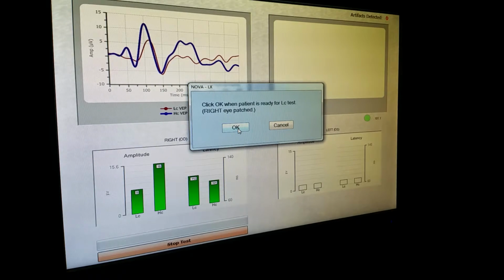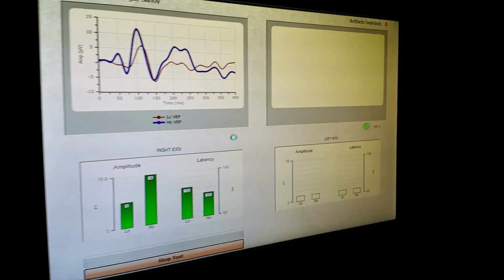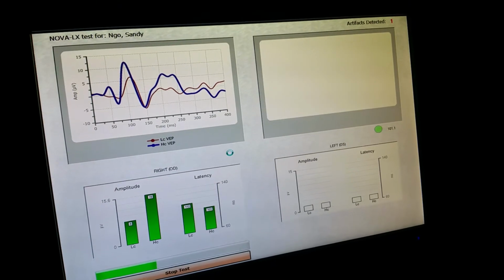All right, so blink a couple of times and look straight ahead for me. Look toward the center of the screen. Try not to move your eye around.